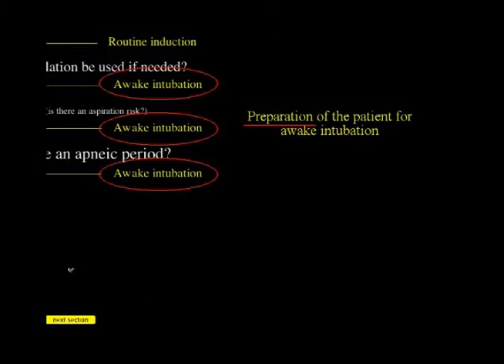The problem I see nationwide, especially when I give this lecture at the ASA, and I see the problem over and over again, when we talk about awake intubation, people have tunnel vision. They have tunnel vision for the blocks, okay? And they do really bad jobs at awake intubation. And the reason why they do bad jobs is they have tunnel vision. We have to prepare the whole patient, not just the blocks for the airway. Preparation does not mean block or topical anesthesia.